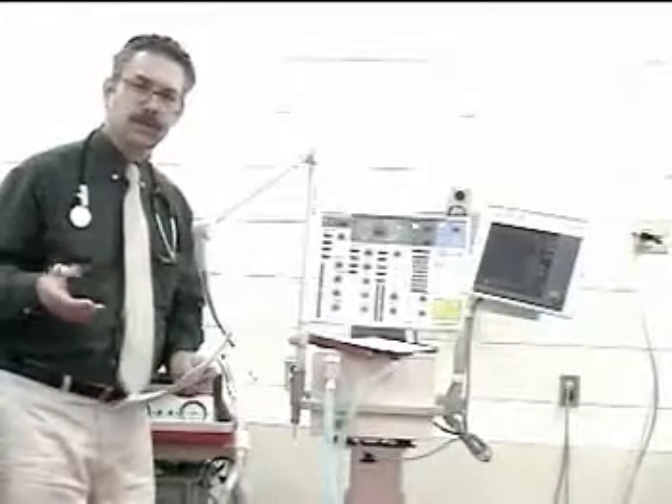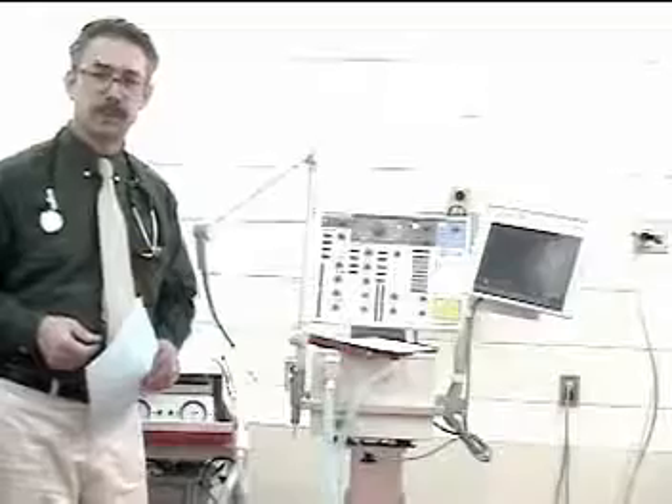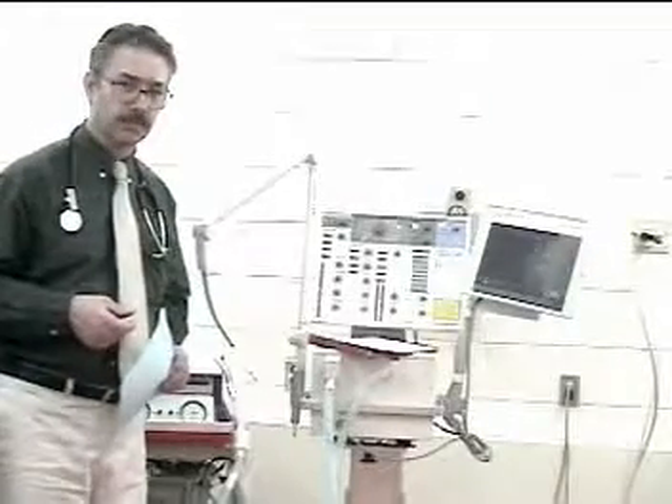That concludes the monitoring of continuous mechanical ventilation on the Siemens Servo 300 ventilator.